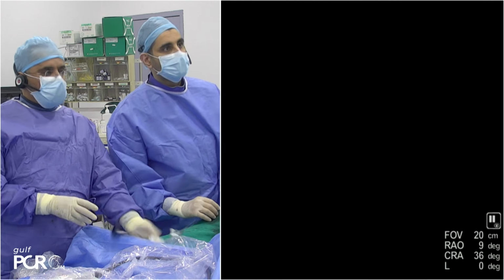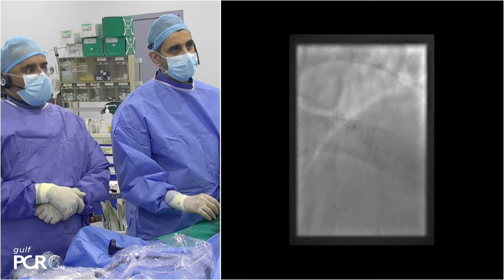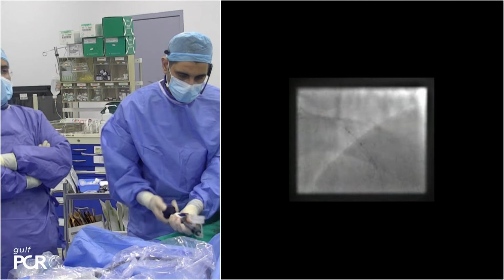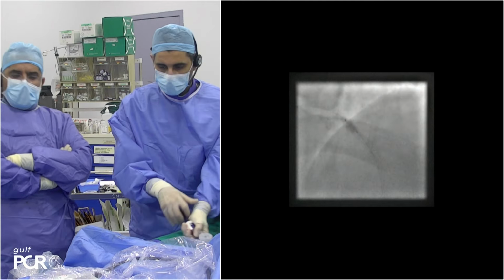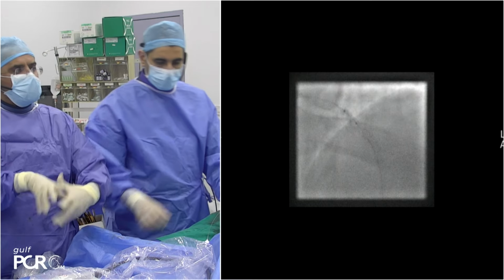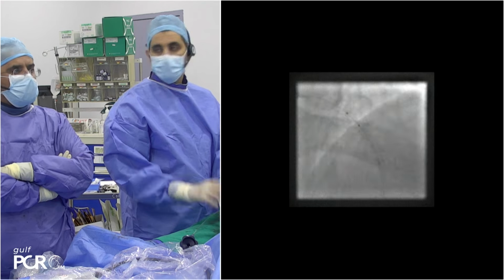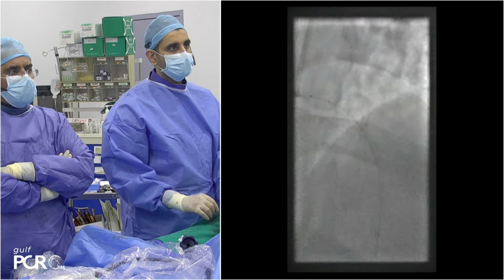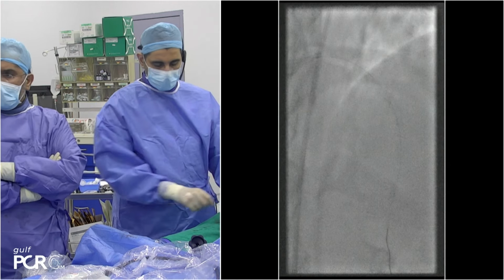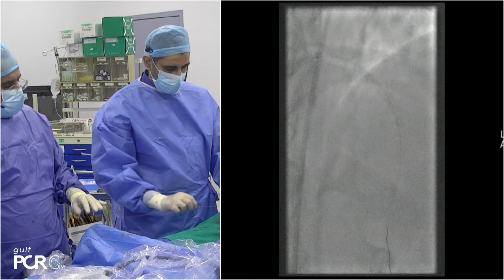Okay, definitely the OCT shows a major improvement by the postdilatation on the distal part, even if we have a residual image of thrombus. But the major problem was the incomplete deployment of the stent in the proximal part. So with a 3.5 balloon, certainly we will get a much better result. Yeah. Okay, let's go try this. We'll give you an angiogram here.